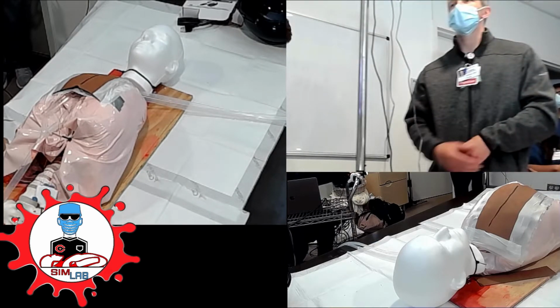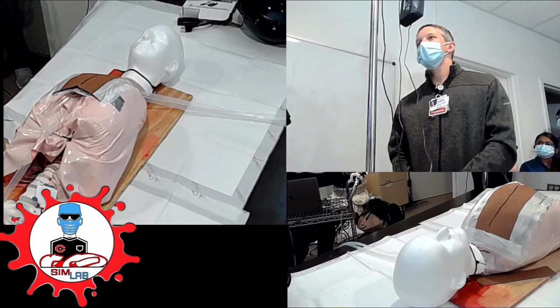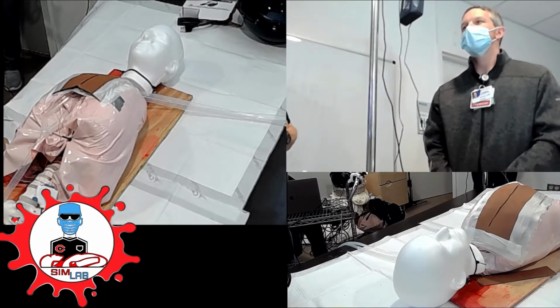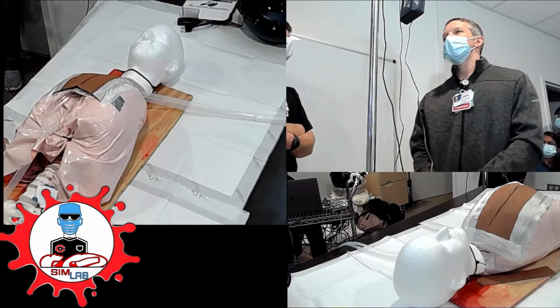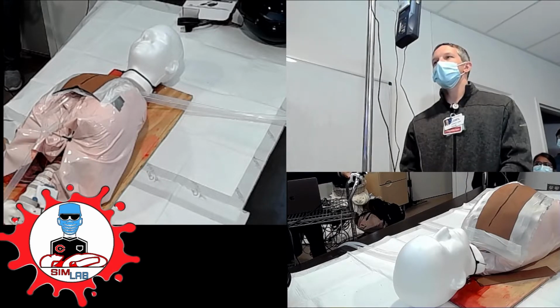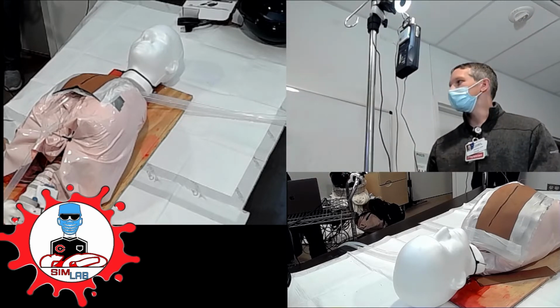Let's say it's already on and you're seeing asystole, you're not seeing any rhythm. Maybe you're seeing a pacer spike, maybe you're not. What would you push on this box? Like how would you adjust it to try to get captured? Either turn up the output or just put it into emergency mode.